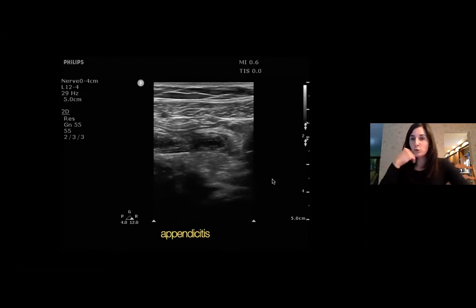But then what do you do with this? Depending on where you work, very rarely a surgeon will say, I believe you, let's bring that patient to OR. It will happen in kids. It will happen in smaller centers when you show them your image and you have a perfect thing. And it's usually when you have a male patient. Because in female patients, there are other things that could fool you that look like this. Sometimes hydrosalpinx looks like this, or some ovarian pathology. And most people would want to have a bit more of a formal thing.